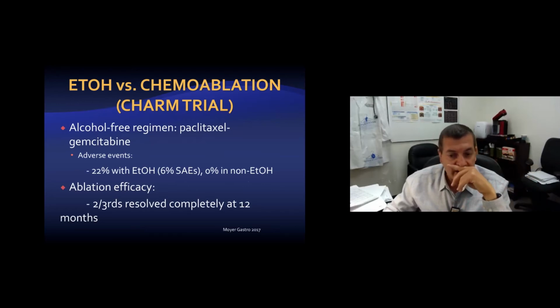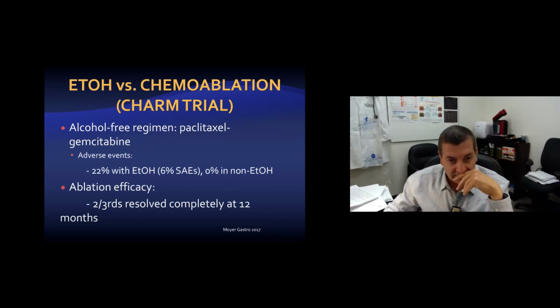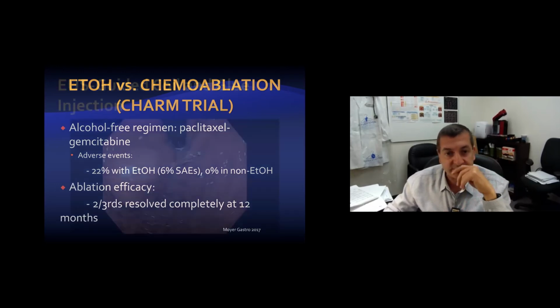And for the ablation efficacy, in this study, using paclitaxel and gemcitabine, the combination was more effective and less risky. They had no cases of pancreatitis.